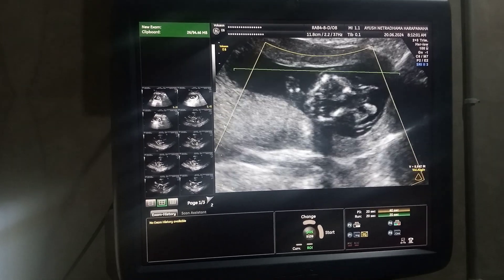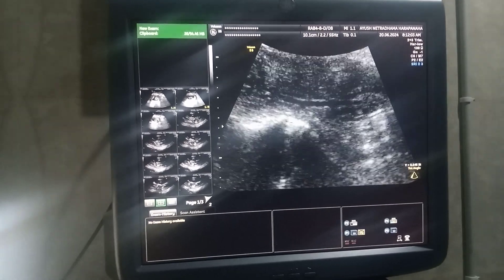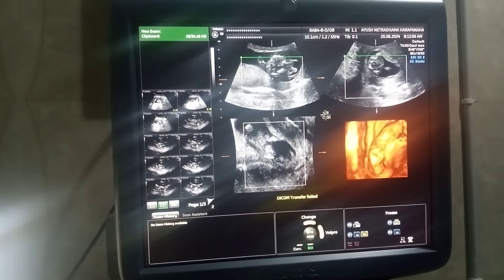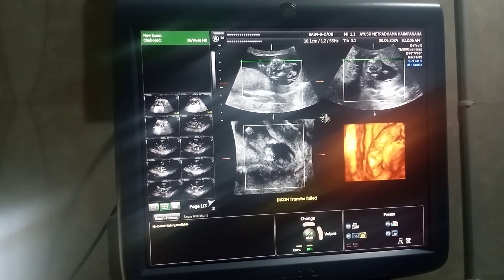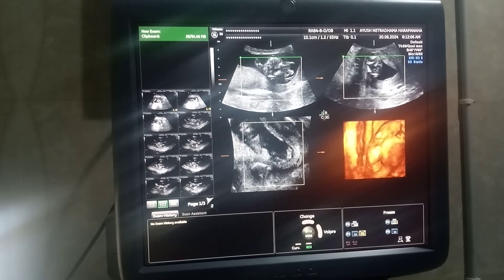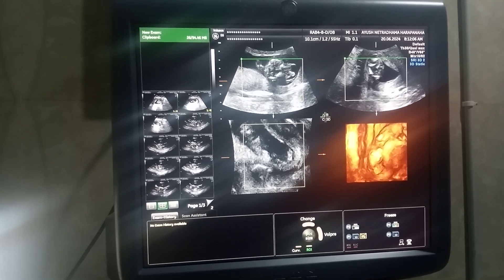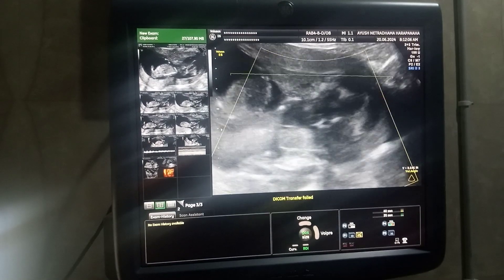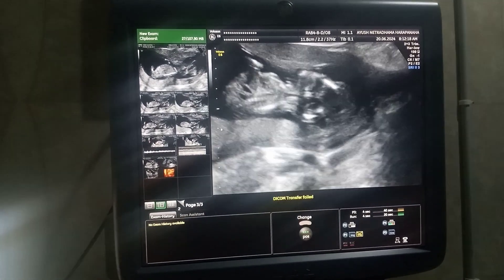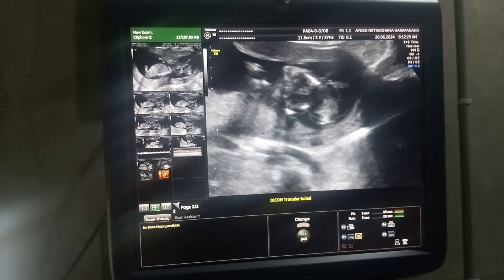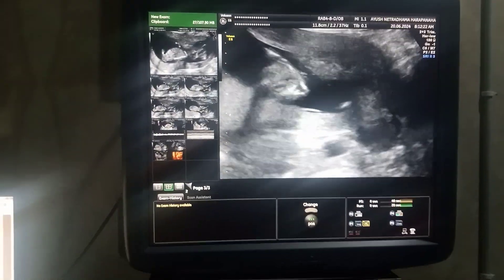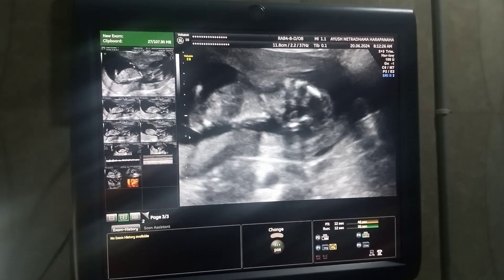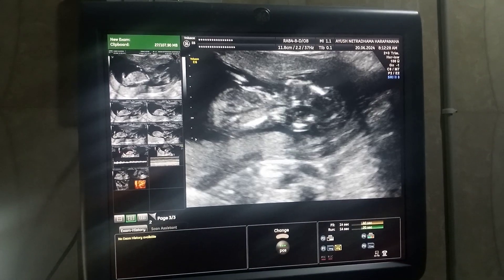Sometimes it is difficult to label it as only an encephalomeningocele, because in encephalomeningocele the skull vault will still be ossified later on. But here, in such appearances where there is gross neuroparenchyma surrounded by a membrane, over a period of time it will become an anencephalus. So it is called acrania-anencephalus continuum.